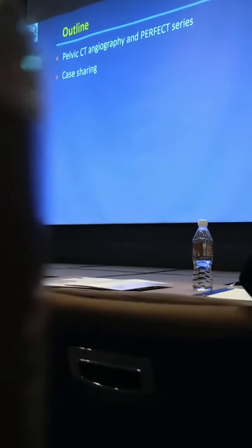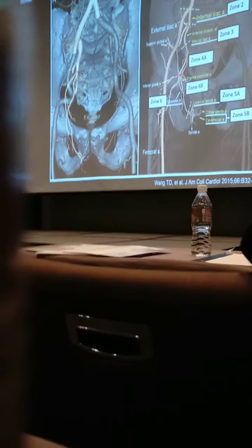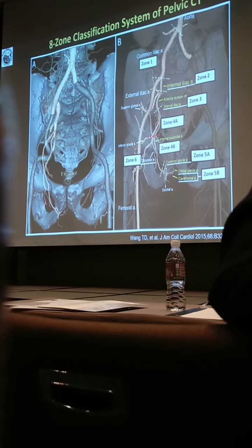In the young patient with erectile dysfunction and pelvic arteriosclerosis. So first, the anatomy of the pelvic arteries. I think the first step to enter this field is to realize the anatomy, and pelvic CT angiography will help you a lot.